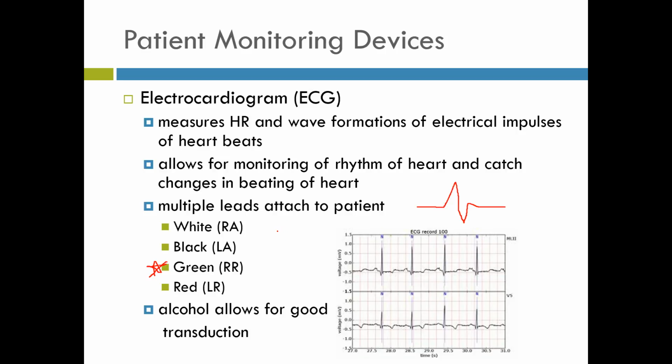So if I had my little stick guy here, my green lead would go down. If this was the patient's right and this was their left, my green lead's going to go down right here, attached in the inguinal area.